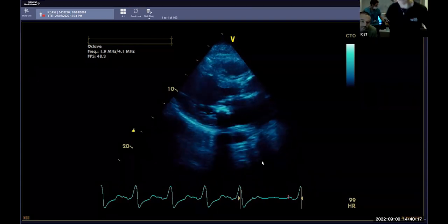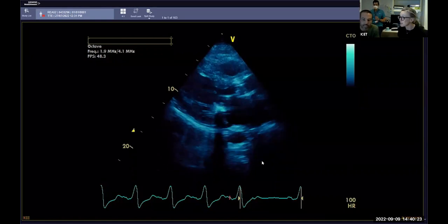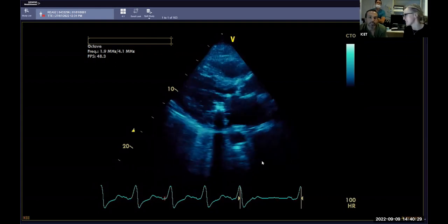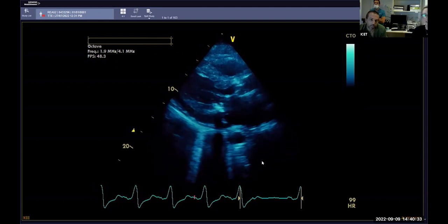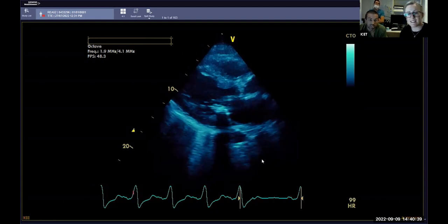So this lady, I don't know if that's what she has. Hypotensive, chest pain and short of breath. Almost kind of making it, but end stage renal failure. Yeah, right. So it might make more sense. And on peritoneal dialysis and came in hypotensive. I mean, her left ventricular walls are certainly thickened. They're going to be 1.5 centimeters, if not more. That can be consequent to the end-stage renal disease.